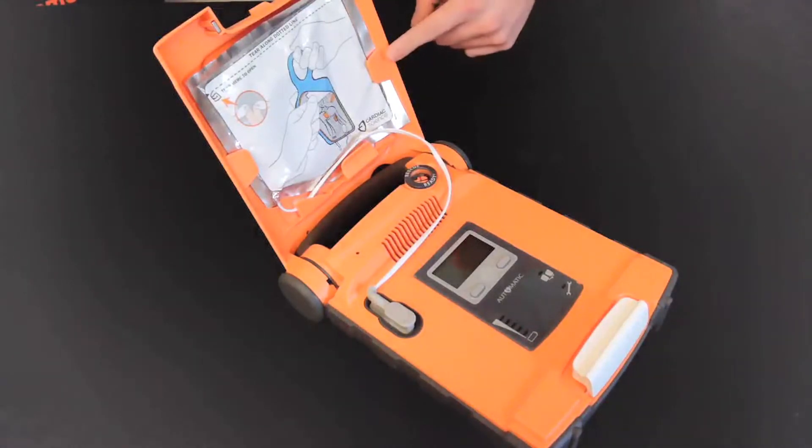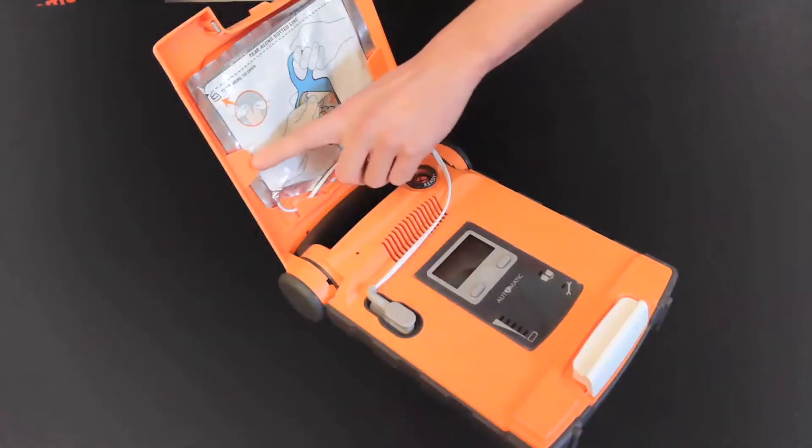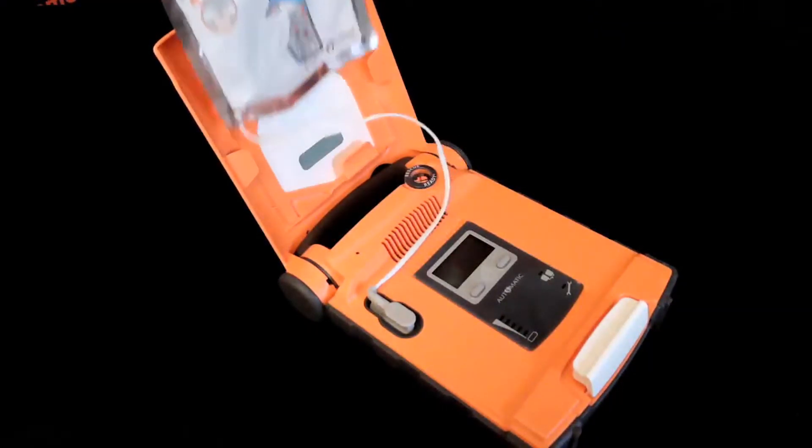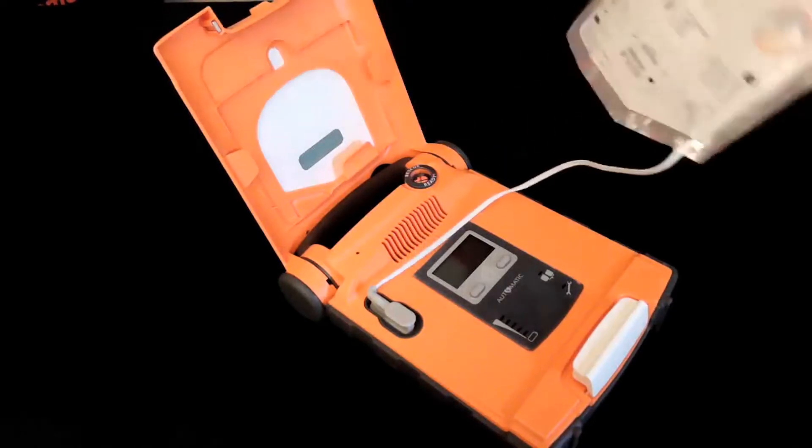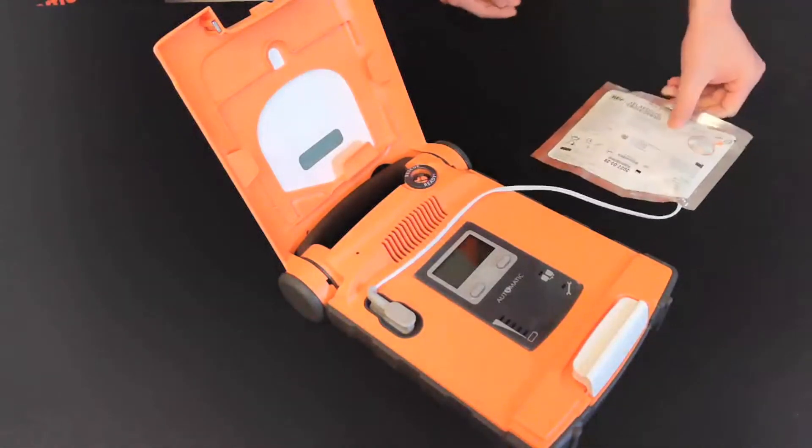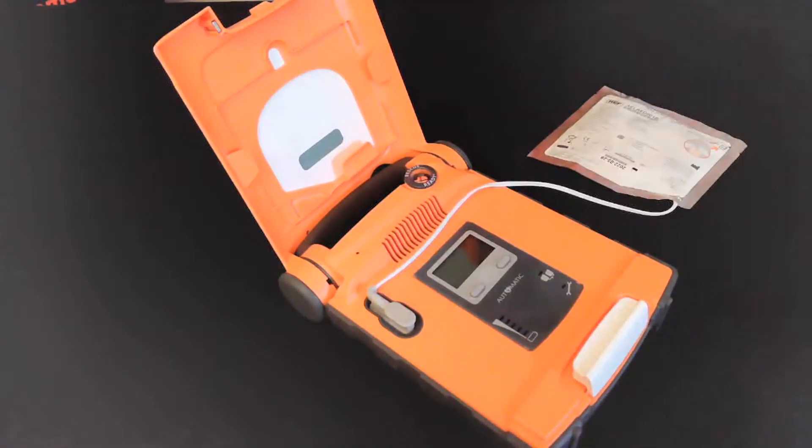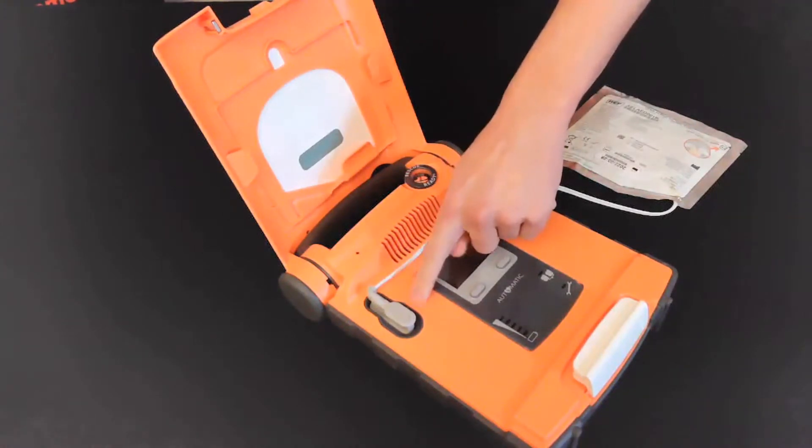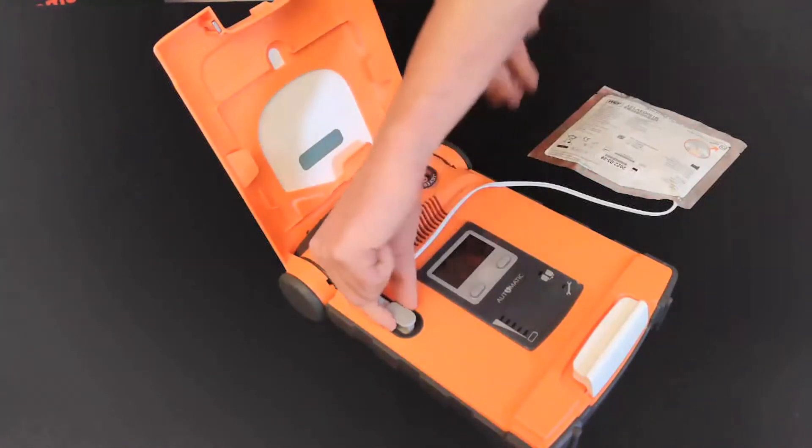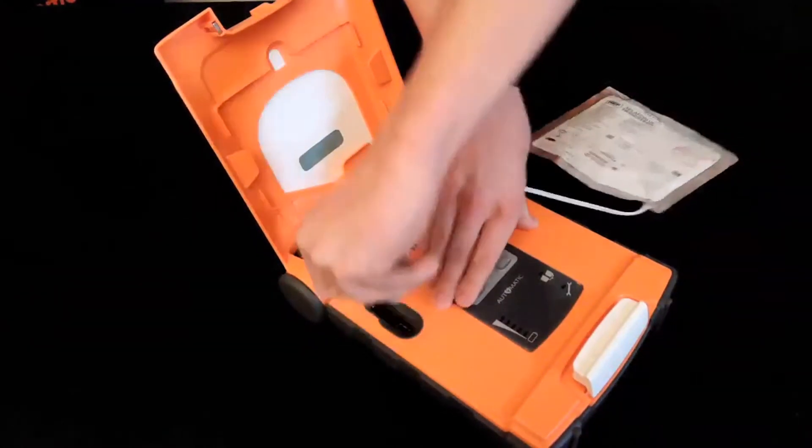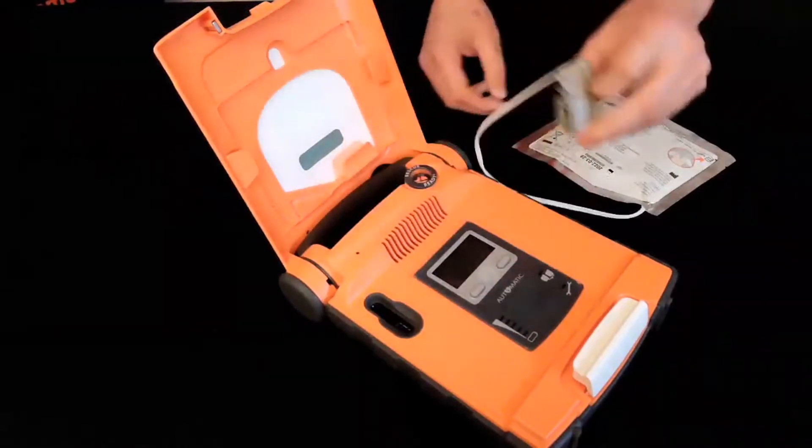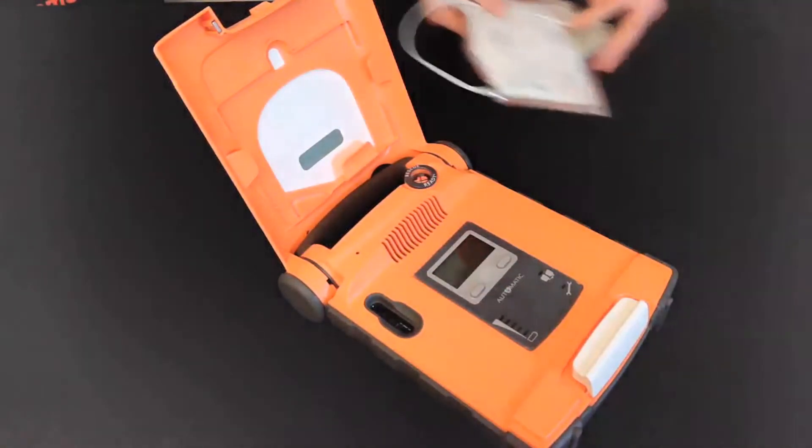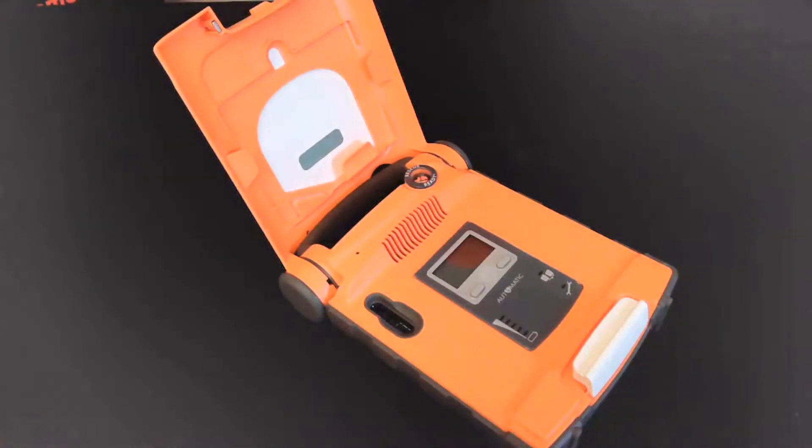Next, remove the foil pad packaging from the guide rails on the lid of the AED. Then, unplug the gray rubber connector on the pads from the AED. Set the expired pads off to the side, keeping them separate from your new pads.